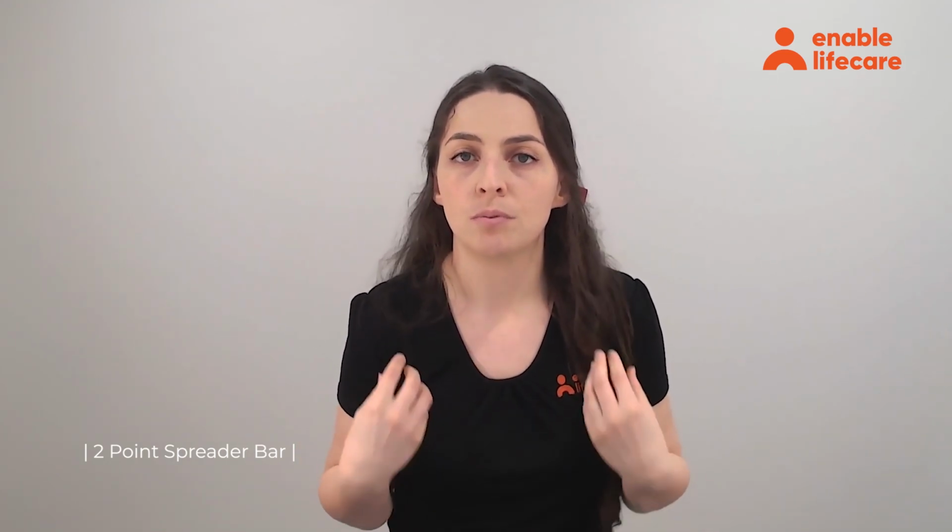Some disadvantages of the 2-point spreader bar though is that it can be uncomfortable for some clients because of that more closed postural position. A 2-point spreader bar is not going to be great for your plus size or bariatric clients because they're not going to have enough space for that additional adipose tissue, especially those clients with that kind of apple body shape. Something also to take into account is with that 2-point spreader bar, that more closed postural sitting position, you're not going to have as much access with your commode apertures.